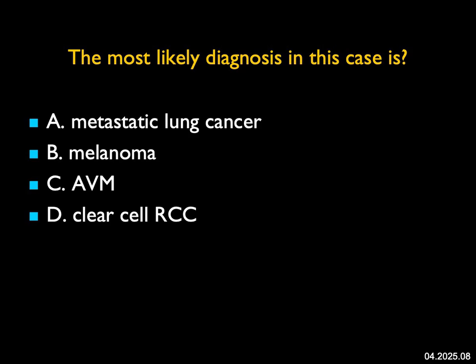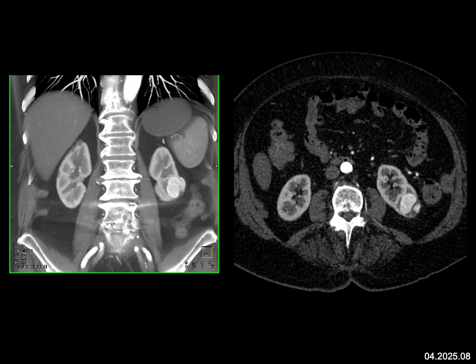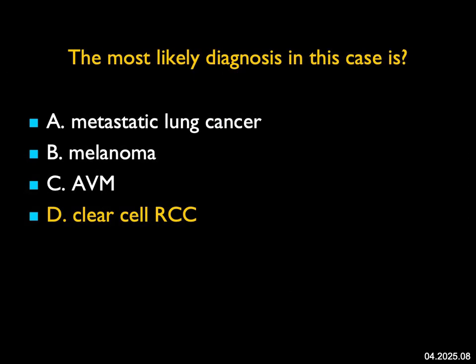The most likely diagnosis in this case — there's a mass about three centimeters at the lower pole lateral aspect of the left kidney. The contralateral right kidney looks okay, and I don't see adenopathy or any other finding. This is a vascular renal lesion. The most likely diagnosis statistically is going to be renal cell carcinoma — 85% of renal cells, and the vascular ones are typically going to be clear cell, which is the answer. This does not have the appearance of an AVM — you don't see feeding or draining vessels. Melanoma is typically not very vascular, and lung cancer metastases to the kidney are usually hypovascular.